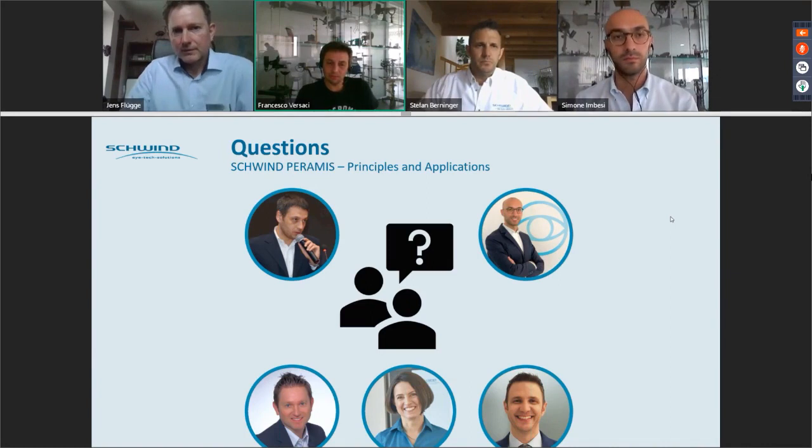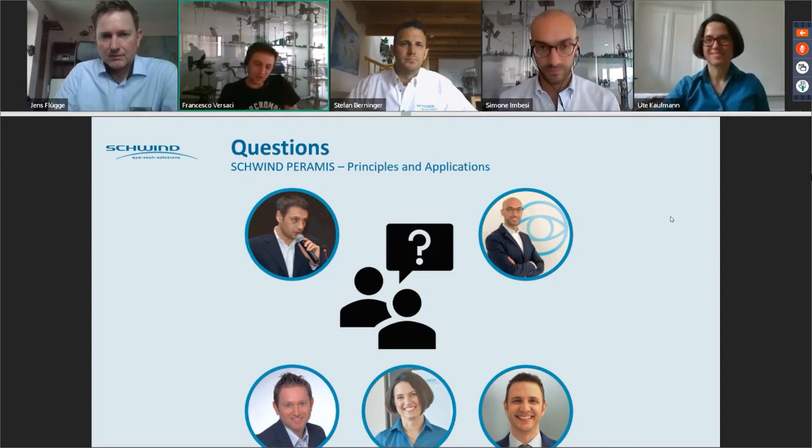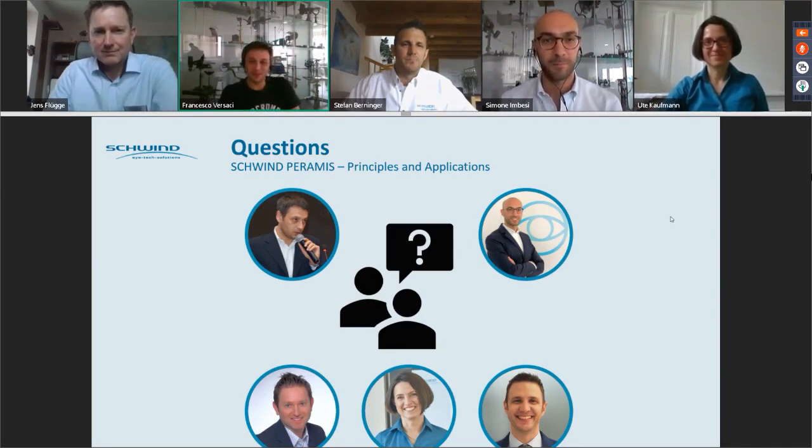On the other hand, I would say that it's pretty interesting to see how sensitive the device is, even to the smallest breakup. And I'm always amazed seeing this, because it matches the accuracy of the device and the fact that it's real time. So even if it's an issue, from the technical point of view, it's pretty amazing to observe how the wavefront changes quickly when you have a breakup.